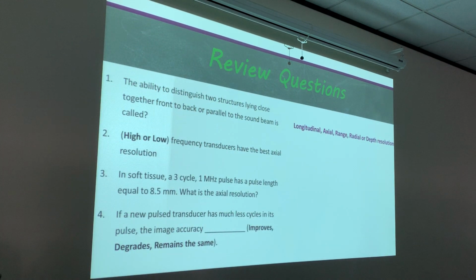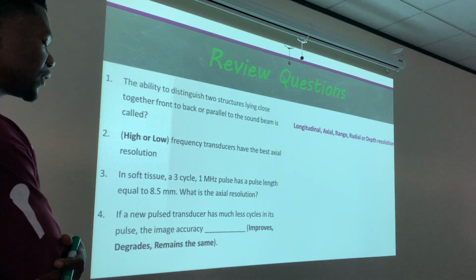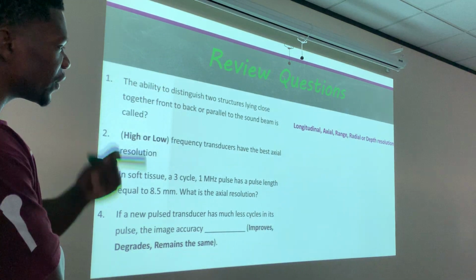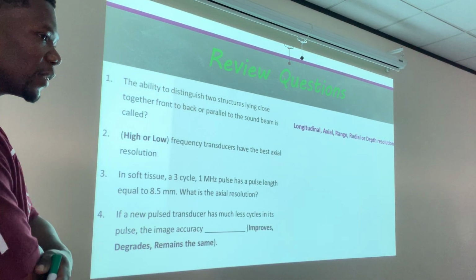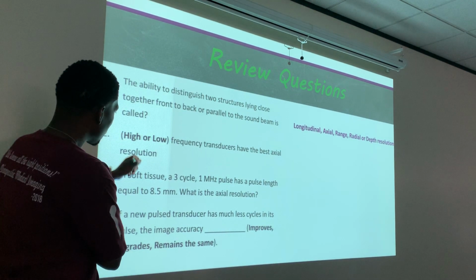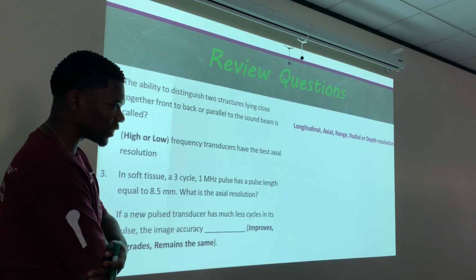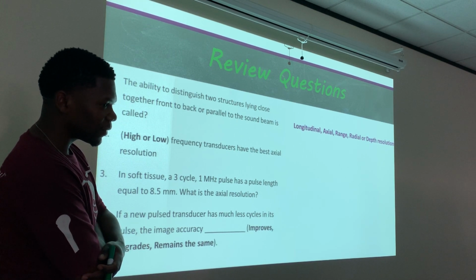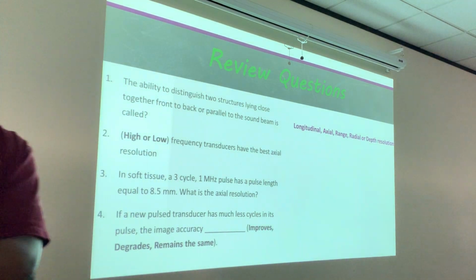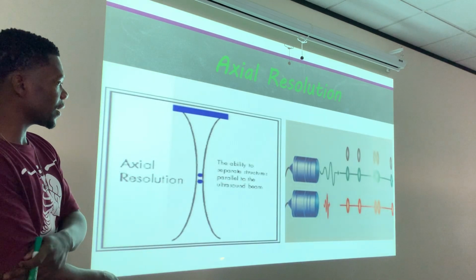Again, next one, guys. Number 2. High or low frequency transducers have the best axial resolution? Higher frequency transducers have the best axial resolution, guys. We just talked about that on the previous slide right here.